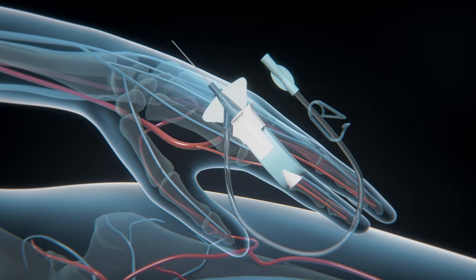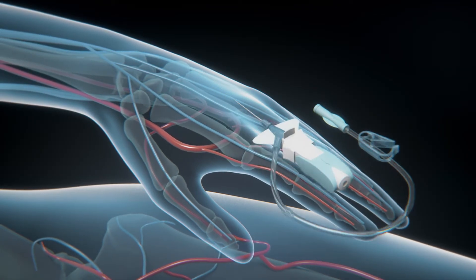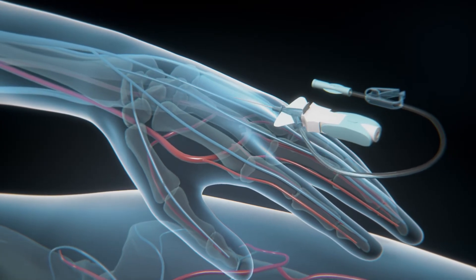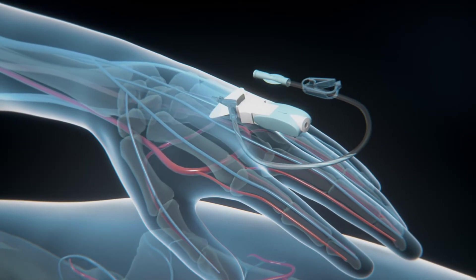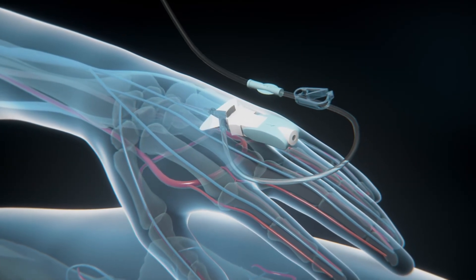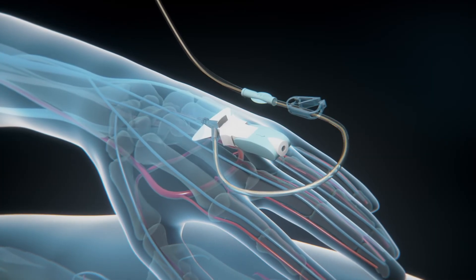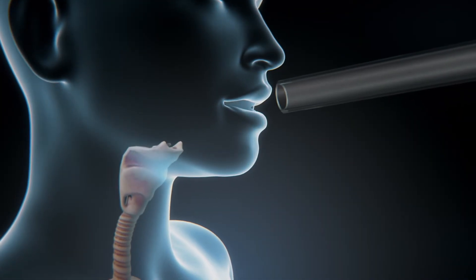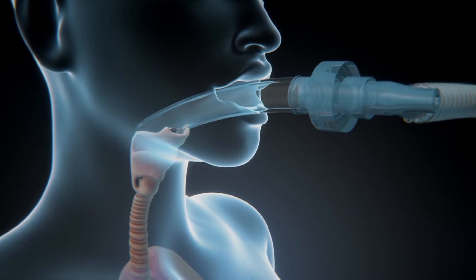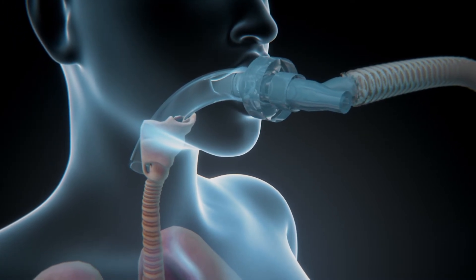Your procedure will begin with an intravenous line, and you may be given sedatives to help you relax. A pelvic laparoscopy is performed under general anesthesia, which will put you to sleep during the procedure. A breathing tube will be temporarily inserted through your mouth and into your throat to help you breathe during the operation.